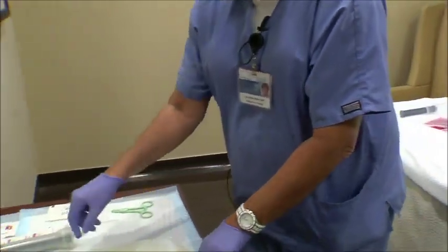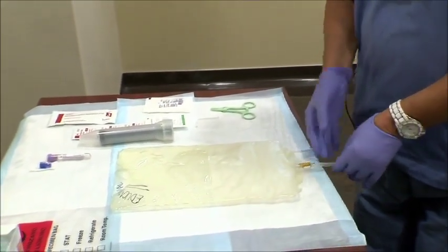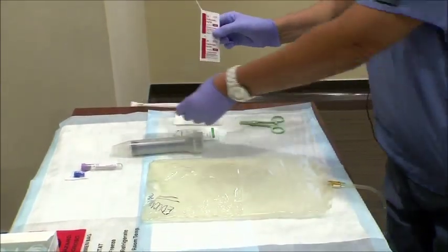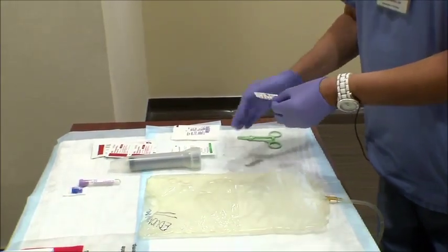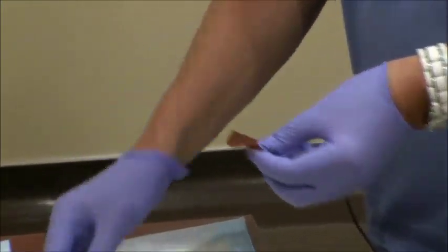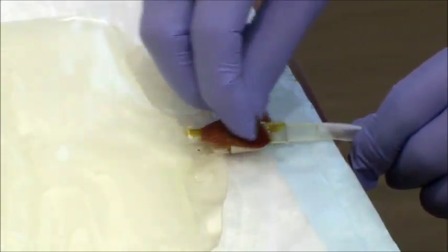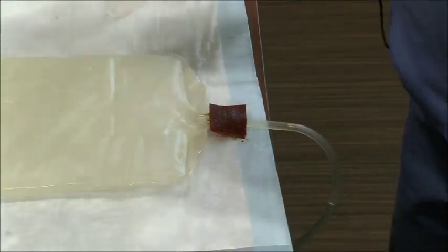On our drain bag, we have a port here. This is where we draw our cultures from. We use a betadine solution, either the pad or the solution. Today I'm going to use the pad. We open the pad and we clean our port with friction, and then we get our butterfly.